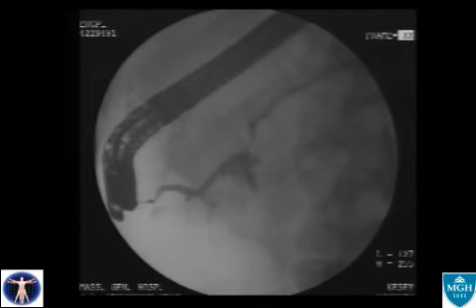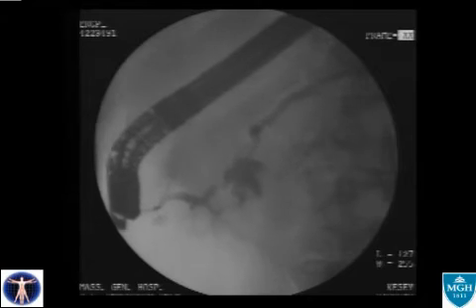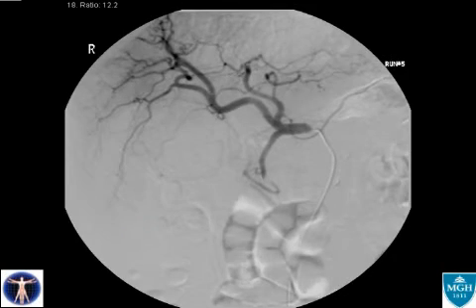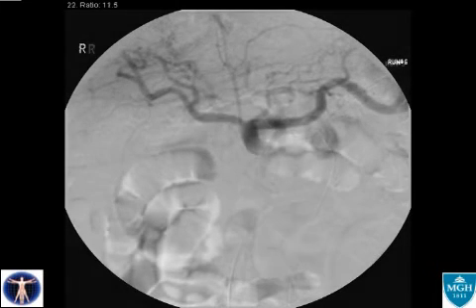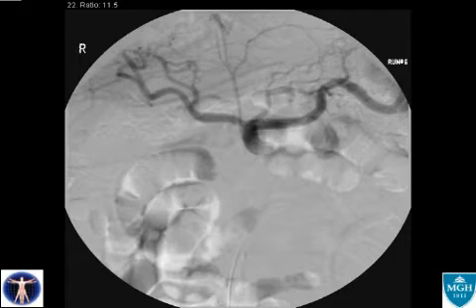Note the cast is passed from the pancreatic duct. A mesenteric angiographic study of the celiac axis demonstrates normal anatomy with no aneurysmal dilation or contrast extravasation.